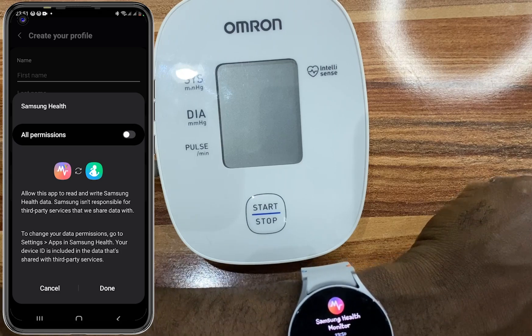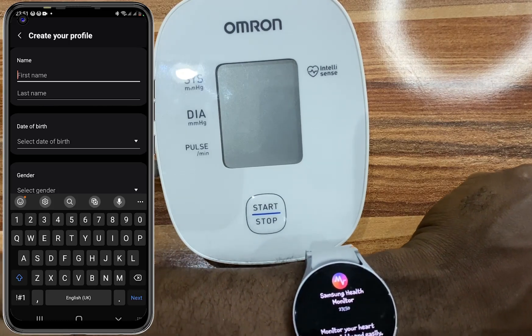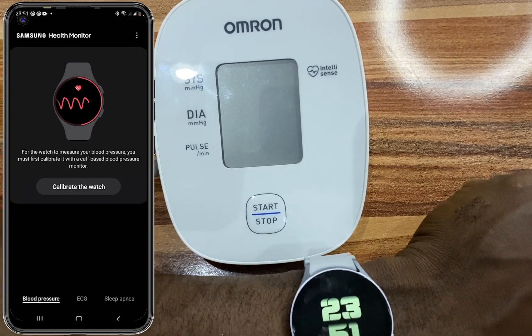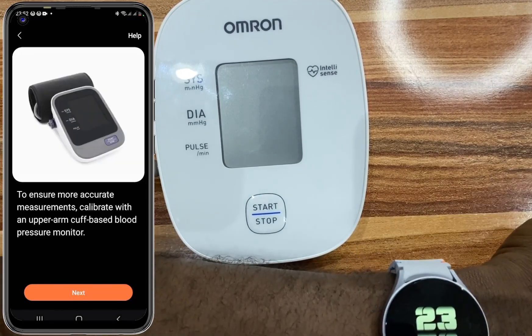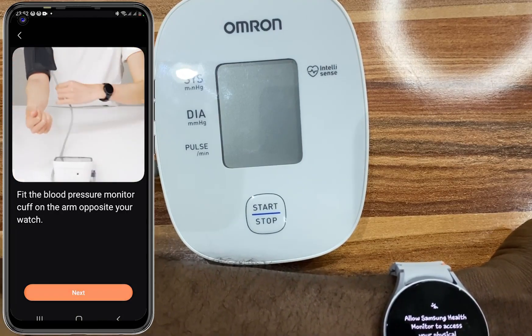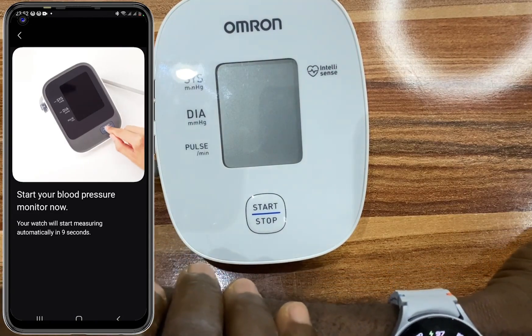Go ahead and enter your details and create your profile. Once you're done, tap on continue to proceed. Now tap on Calibrate the Watch, tap on Next, read through the information, and tap on Next. Tap on Get Started, then Next, then Next again to proceed. It is time to start the blood pressure monitor.